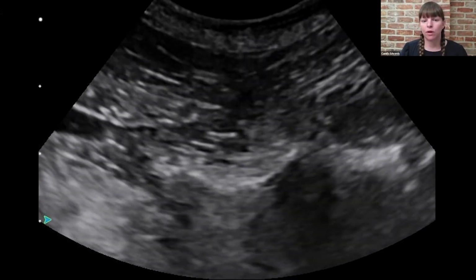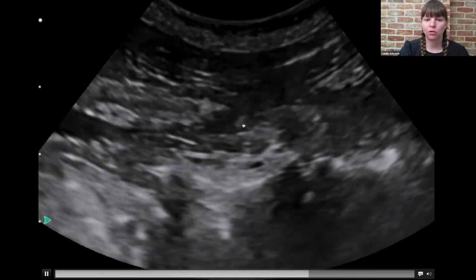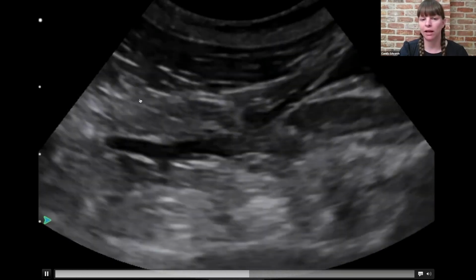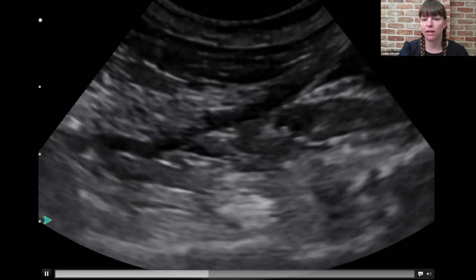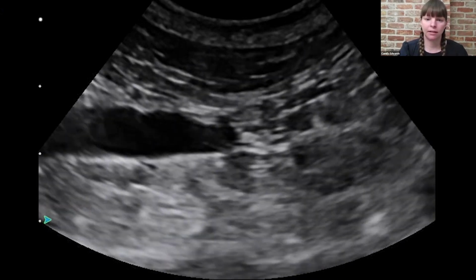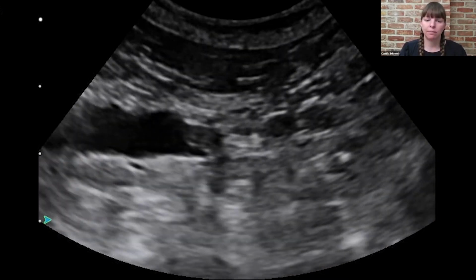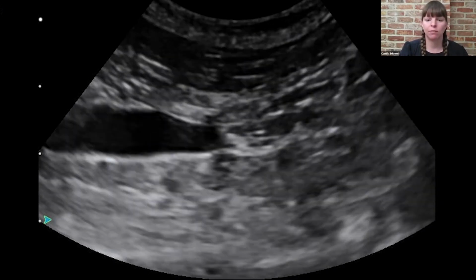So here's an example of neoplastic lymph nodes. So again, we've got the aorta coming in across here, and we meet the trifurcation here. So we've got the external iliac artery shooting off here, and we've got a hypoechoic structure here, which is our left medial iliac lymph node. But not only that, we wouldn't normally see many lymph nodes in this area, but we can see a lot of the other iliosacral lymph nodes, which are quite large as well. So we have one here just below the external iliac artery, and we have another one down here. So multiple large, round, dark lymph nodes in this area. And what we found was that this dog had a transitional cell carcinoma in its bladder, and it had spread locally to these draining lymph nodes.